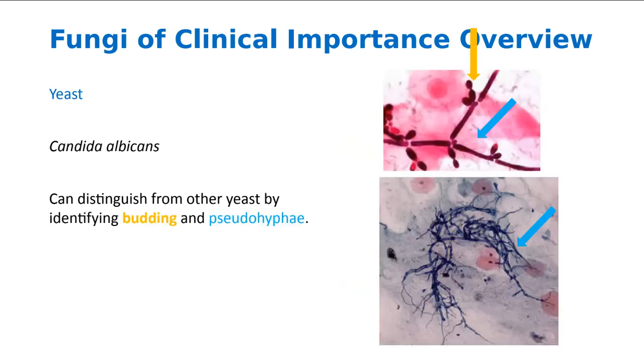Okay, this is Candida, right? So I've color coded my arrows to help you see things, right? So the top, this is Candida albicans, right? It causes thrush, oral and anal thrush. It also causes yeast infections, vaginitis. Okay, so if you look at the top slide, the top slide is a slide from the vagina of some female. And so you can see the epithelial cells in the background, but you can also see the budding yeast at the golden arrow. Can everybody see that? Everybody with me?